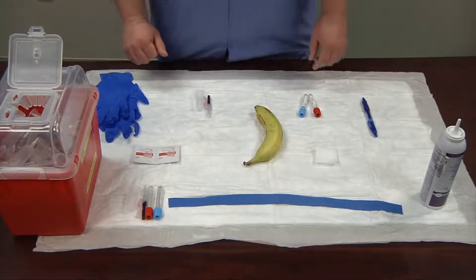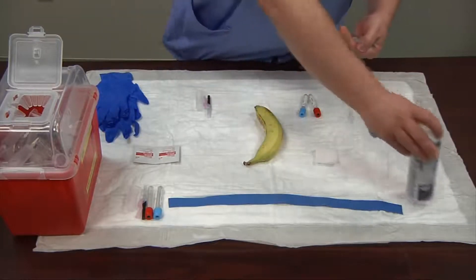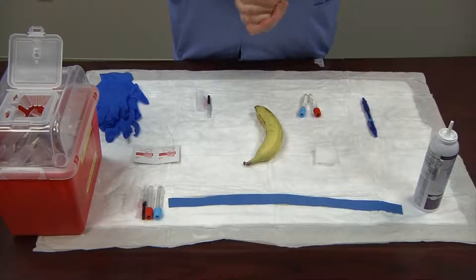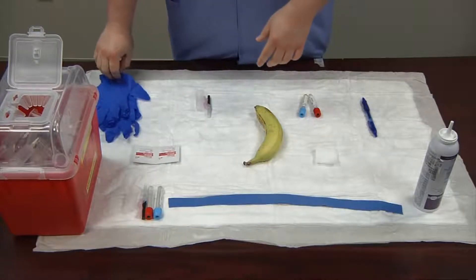The first thing I'm going to do is wash my hands. It's important to always wash your hands before and after every patient. When using an alcohol wash, rub your hands vigorously until the substance is dried. If you're washing with soap and water, you'll need to sing the Happy Birthday song twice in your head to wash your hands long enough.